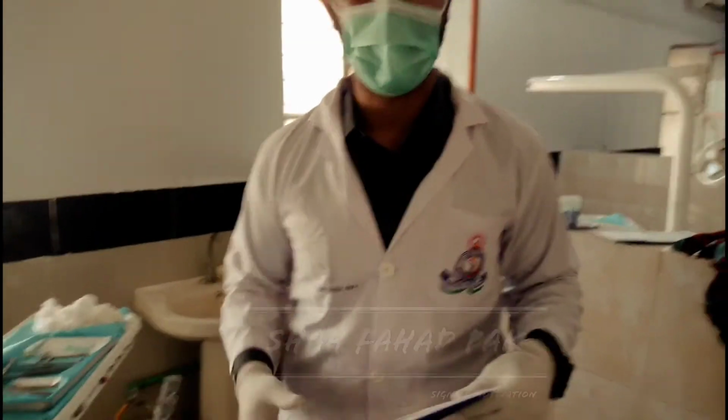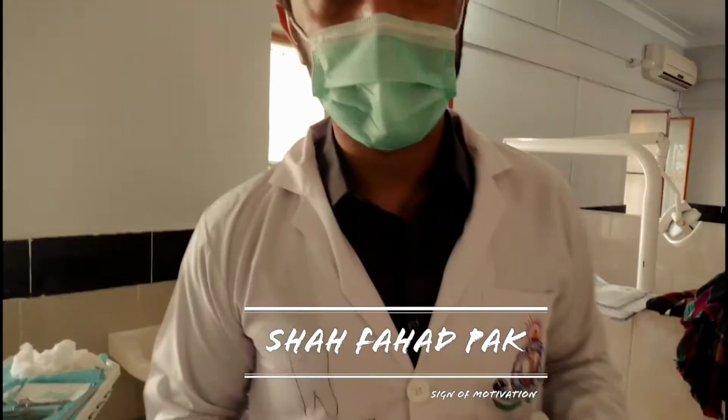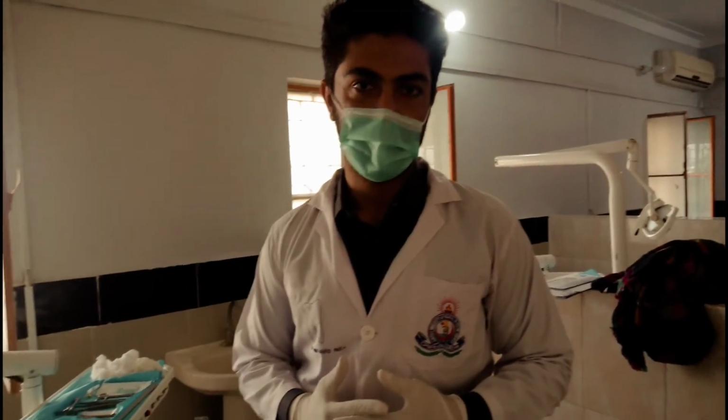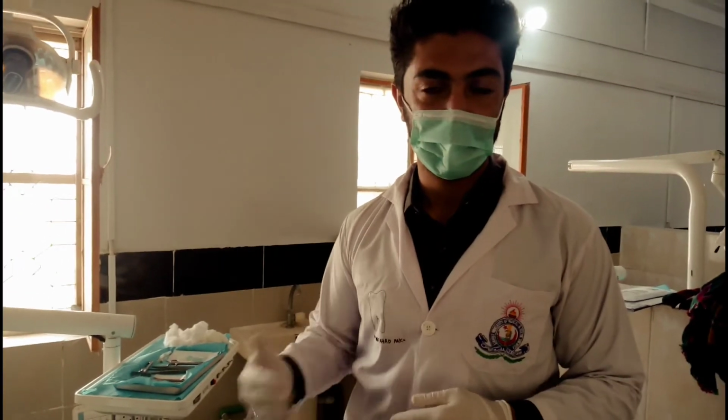So today we are doing biopsy. Basically, I will tell you what a biopsy is. Biopsy is taking the oral tissues for pathological examination to check the histology of any suspected lesion which we cannot diagnose otherwise. So we will take that oral tissue and send it to the laboratory to check the histology, like what is suspicious, what that lesion is.